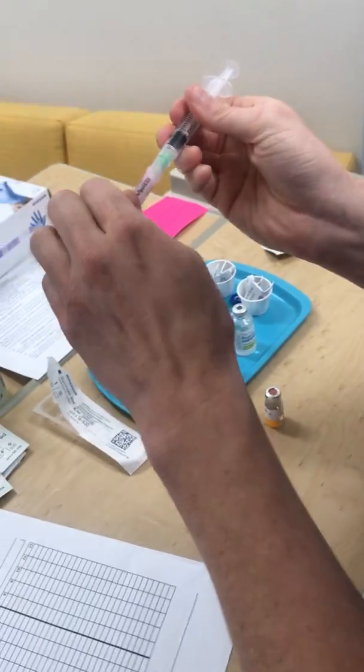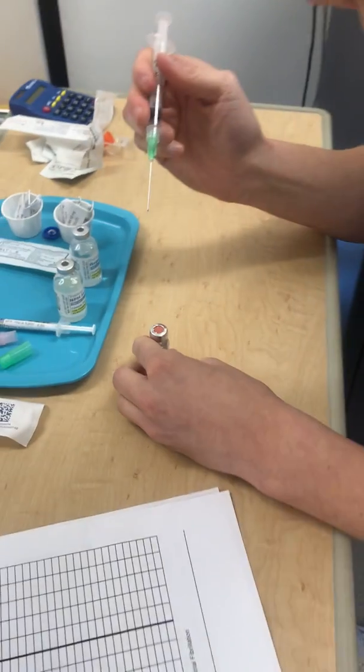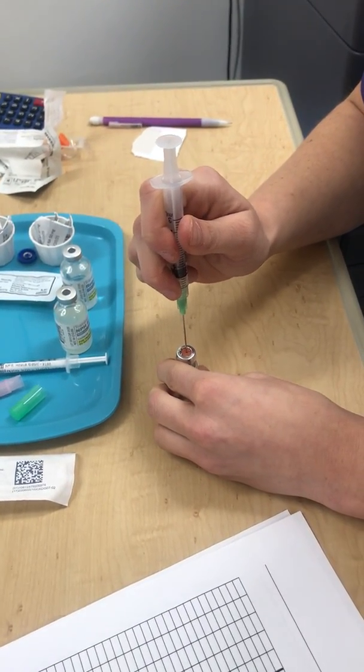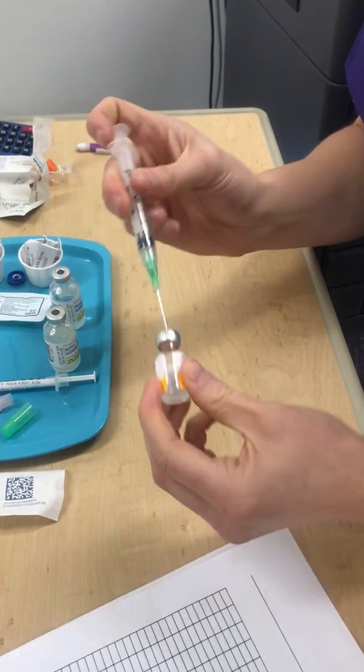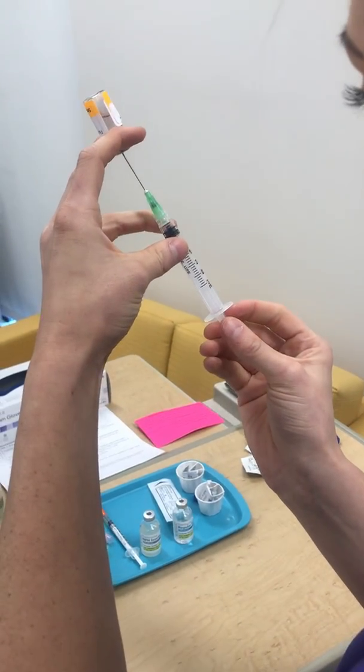And then I'm going to pull this straight off. And then I'm going to make sure I'm not touching the liquid, and I'm going to inject my air in. And then I'm going to tip it back, make sure my needle's in the liquid.